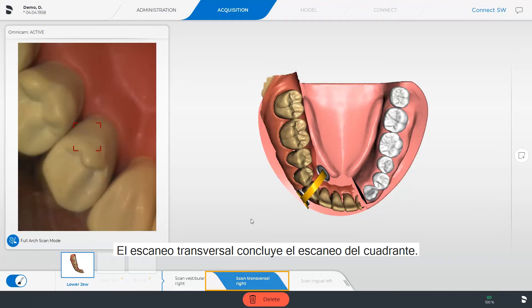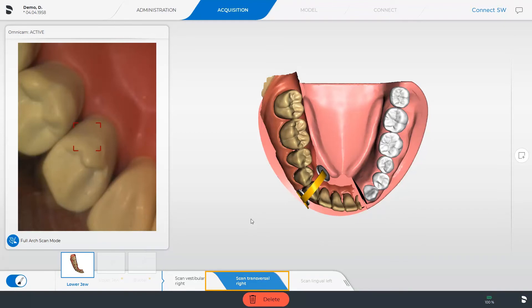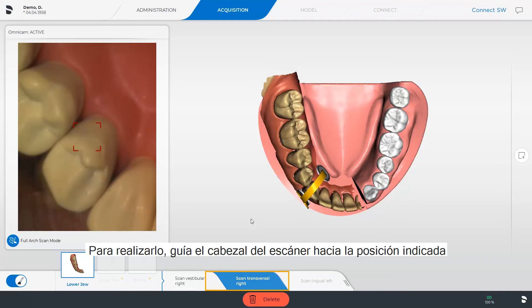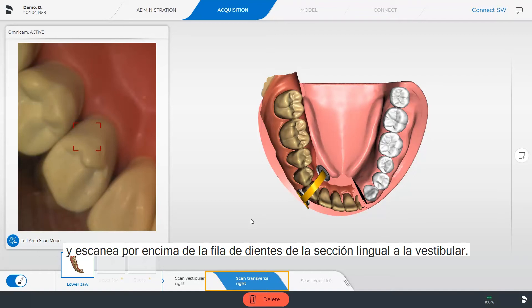The transversal scan concludes the quadrant scan. To do this, guide the scanner head to the indicated position and scan above the row of teeth from lingual to vestibular.